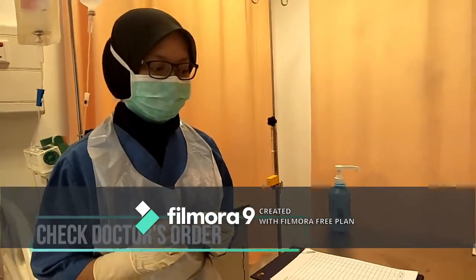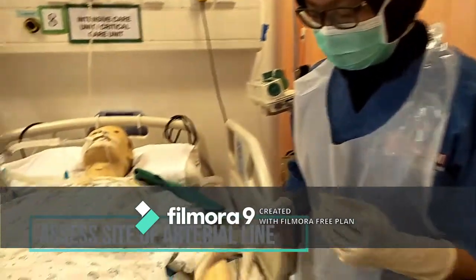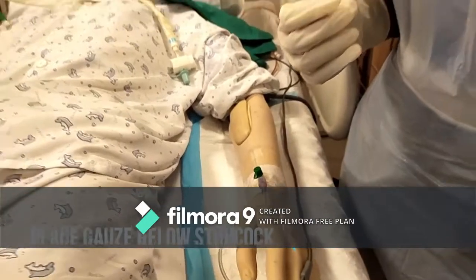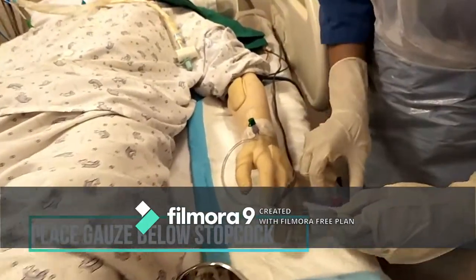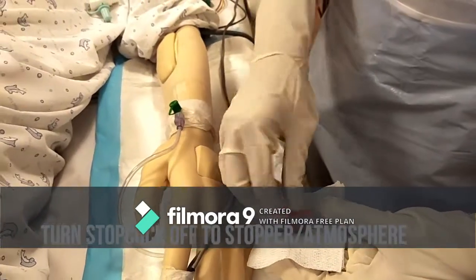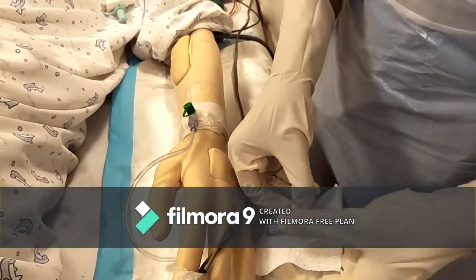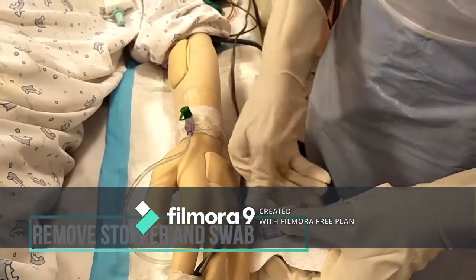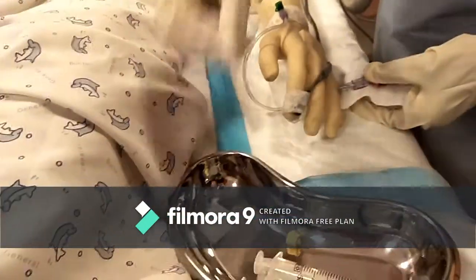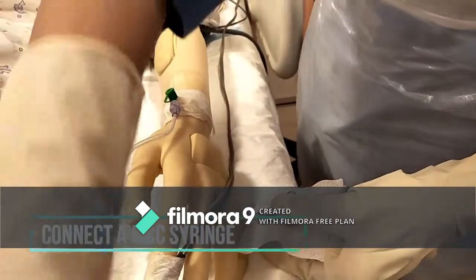First, check the doctor's order. Next, assess the site of the arterial line. Place the gauze below the stopcock. Turn the stopcock off to the stopper. Remove the stopper and then swab. Connect a 5 cc syringe.